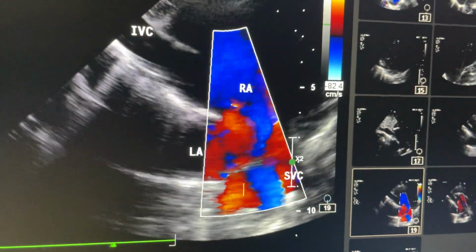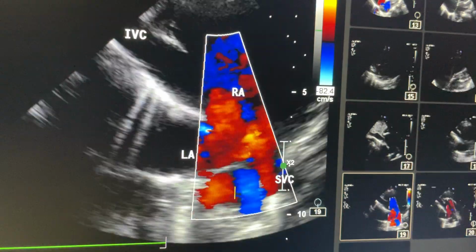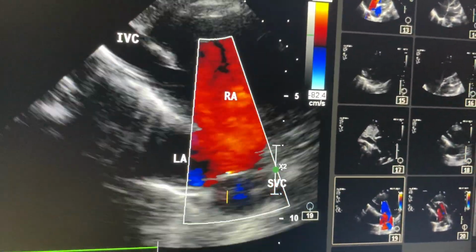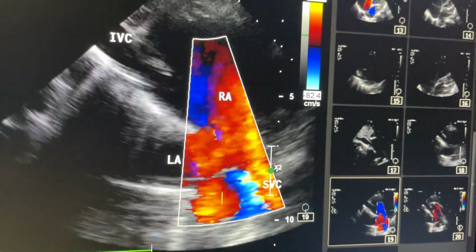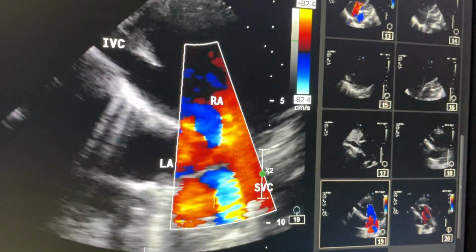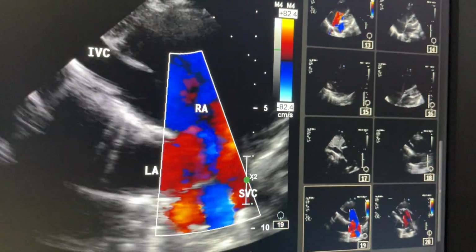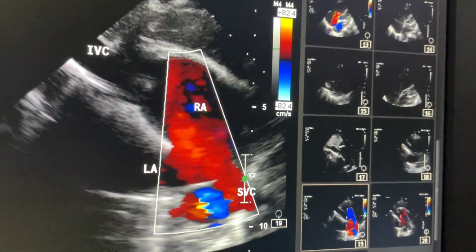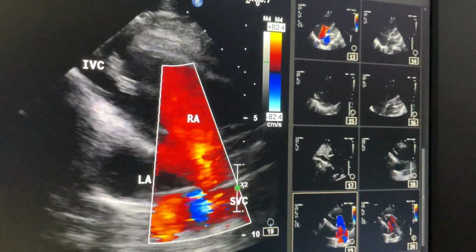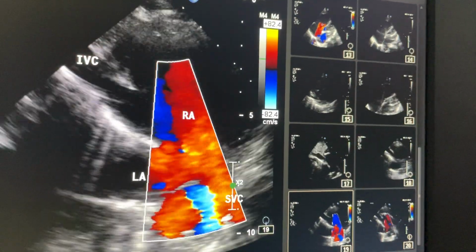So whenever you have any confusion regarding sinus venosus ASD, in the subcostal window the bicaval view, in which you see both IVC and SVC, is the view which will show you the sinus venosus ASD in almost all cases. Obviously, this view is obtained in the sagittal plane. So in the sagittal plane you can make this kind of window, this kind of image, the bicaval view.